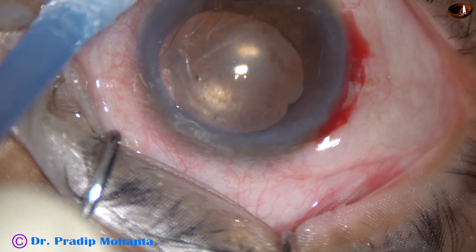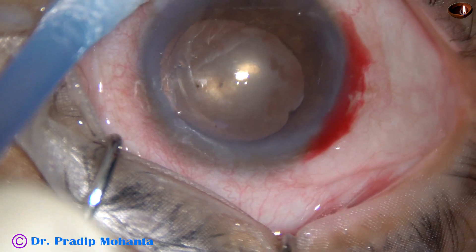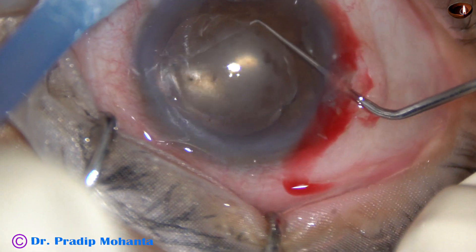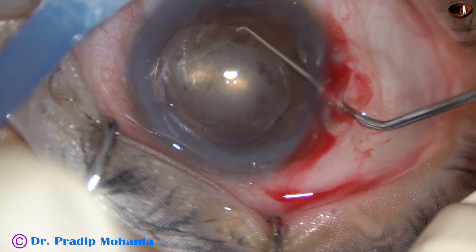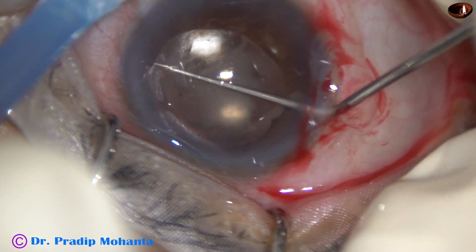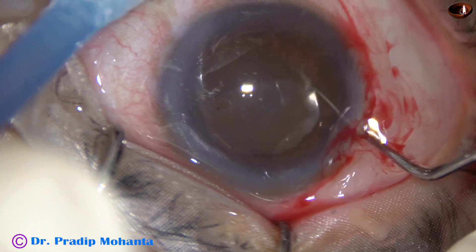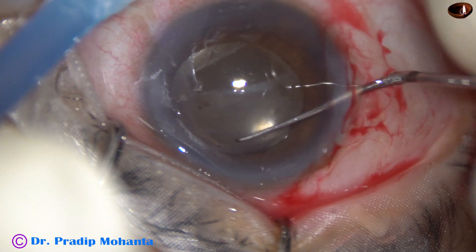Now I take a Szynski hook, pierce the membrane just adjacent to the anterior capsular rim, and tear off the membrane.